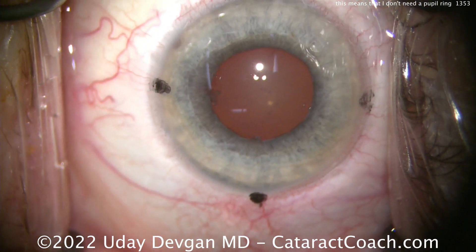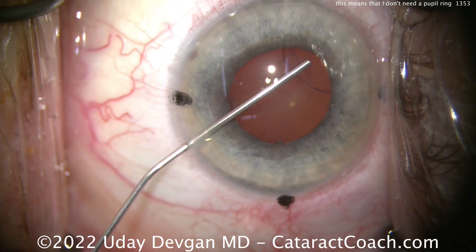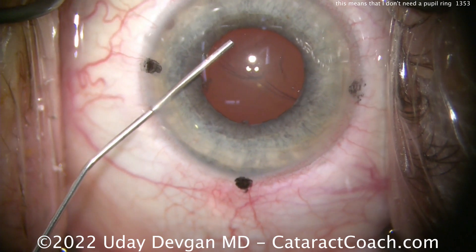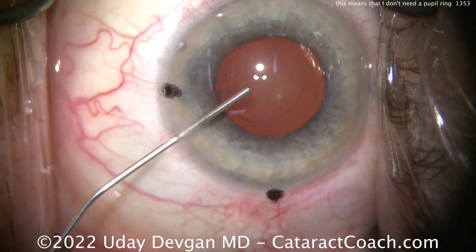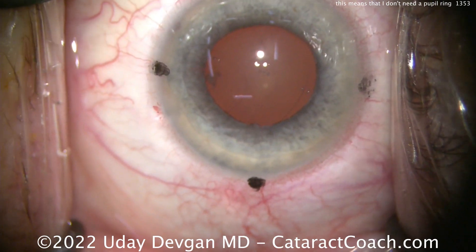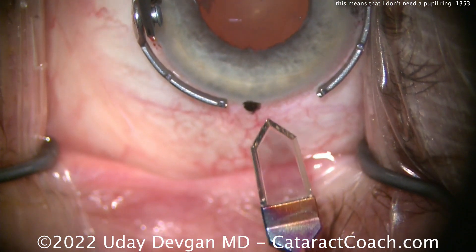You can see I've marked off the cardinal meridians. We're going to put a toric lens in here. We're going to put our anesthetic. Now here comes the viscoelastic. We'll try to do a little bit of viscomydriasis, as Osher calls it. And that's about the max pupil size we're going to get. This patient does take Flomax, and this is all you get with multiple doses of dilating drops.